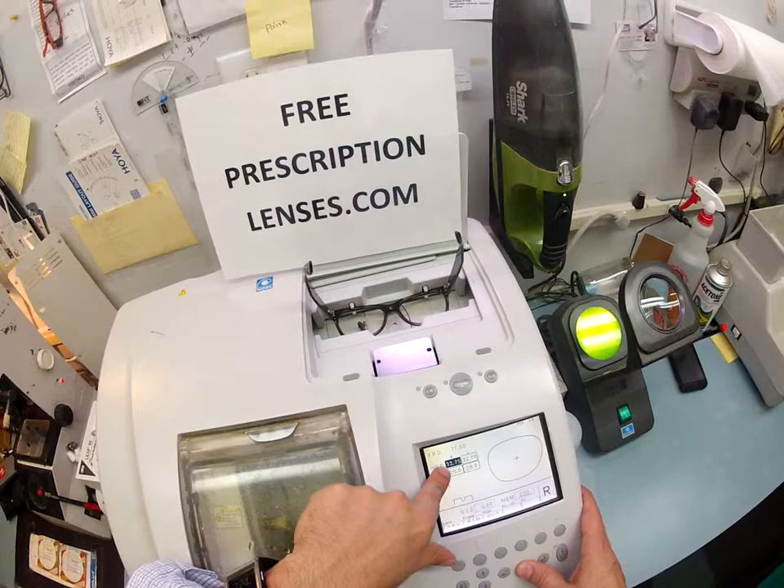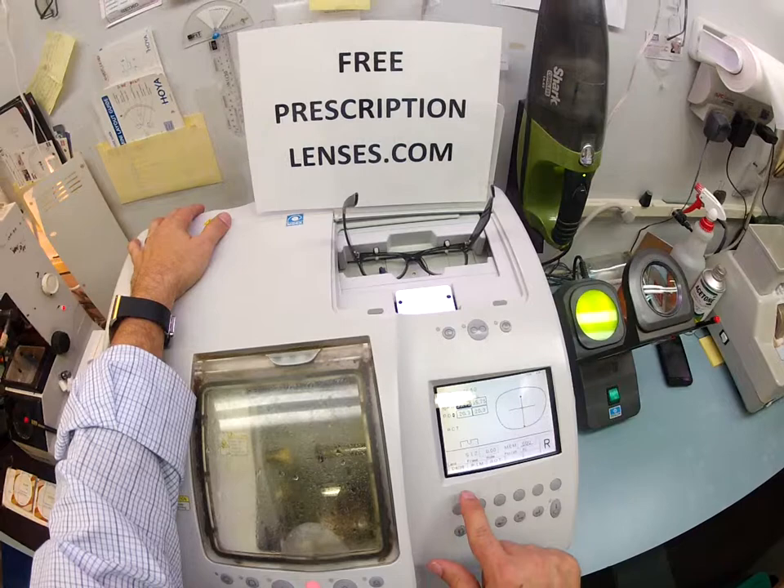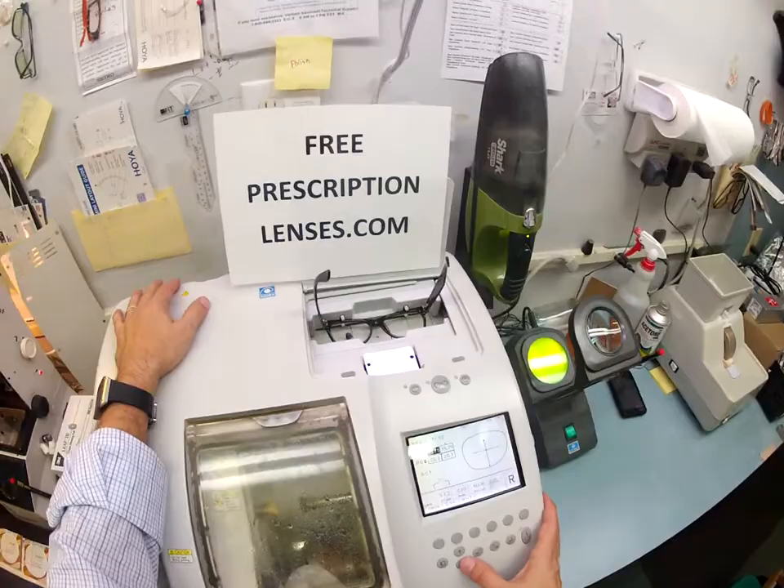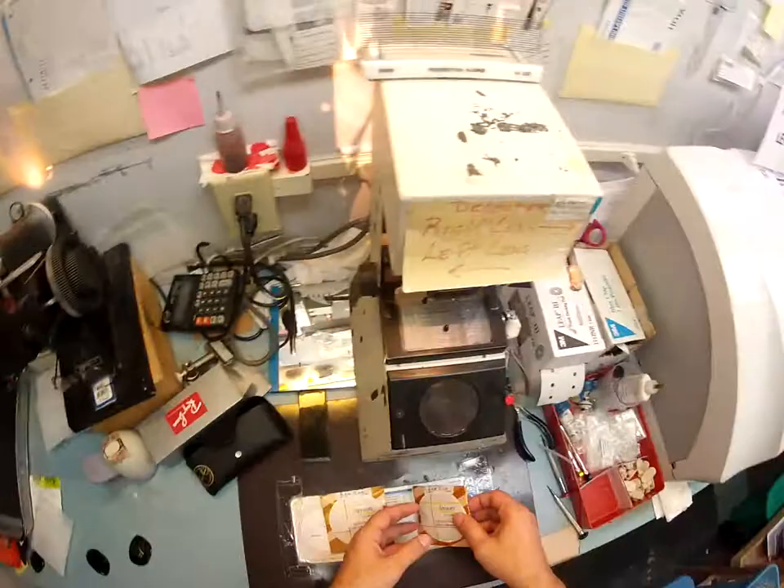If this were a prescription, I would put your pupillary distance in, but these are not, so I'm going to type in the frame PD. This is a polycarbonate lens. I've got to cycle back through — I'm going to cut it on the soft cycle because of the anti-glare, and this is for an nylon frame. I almost know from experience these are going to cut large, so I'm going to take it down just a little bit and I'm probably still going to have to take it down some more.